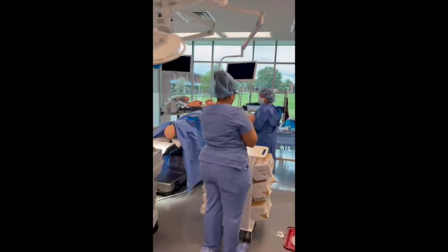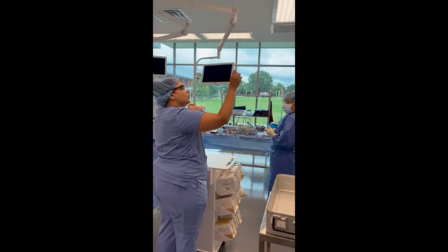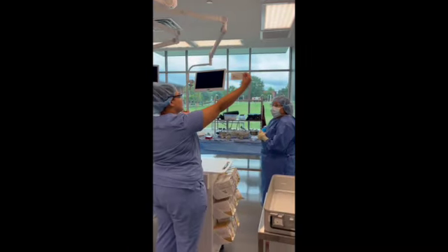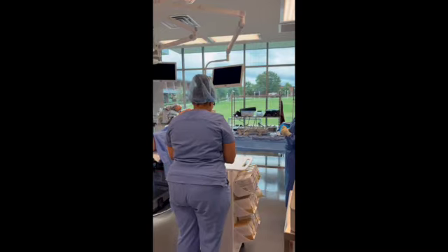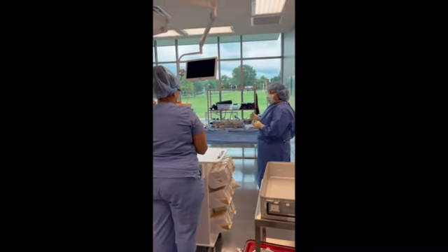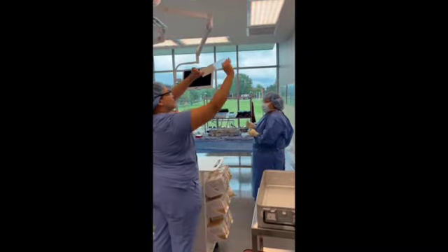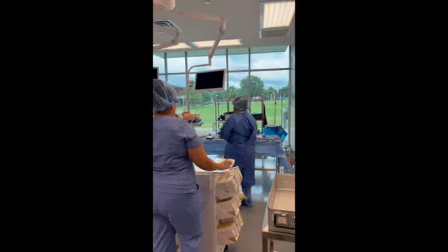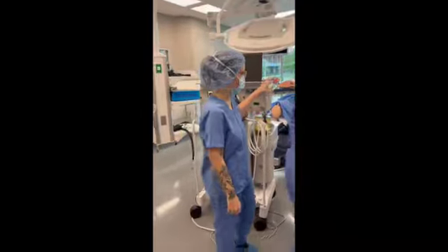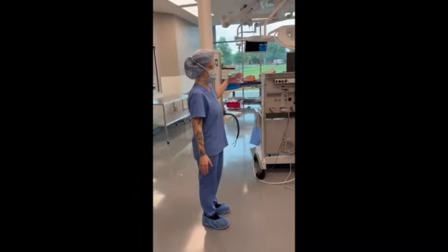Okay, so we have a suture. Expiration date is good. There are no holes. Package integrity looks good. Thank you. Go and check the package. Okay. Package integrity is good. Thank you. And then once she has given off the supplies that she needs to, she will get away from the sterile field, and the surgery will progress.